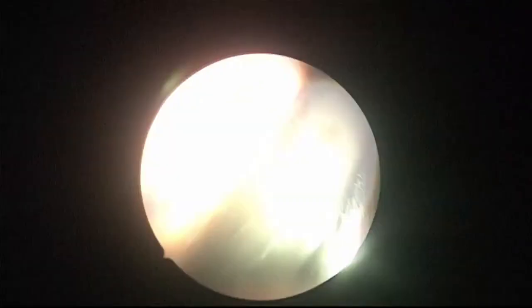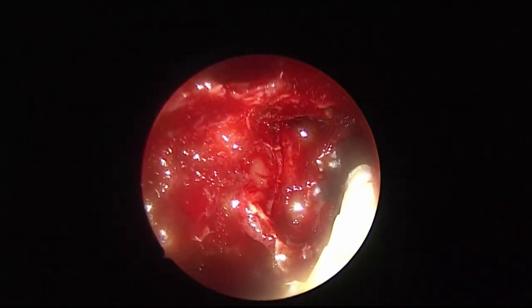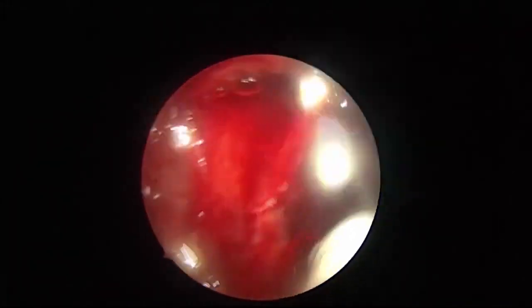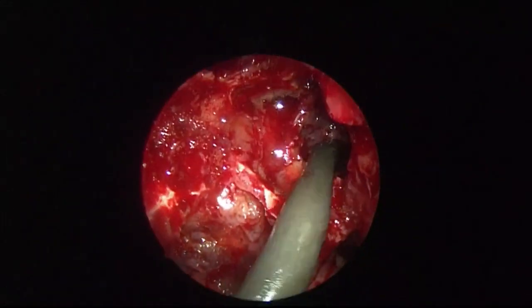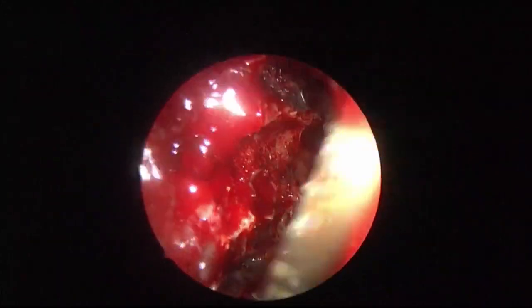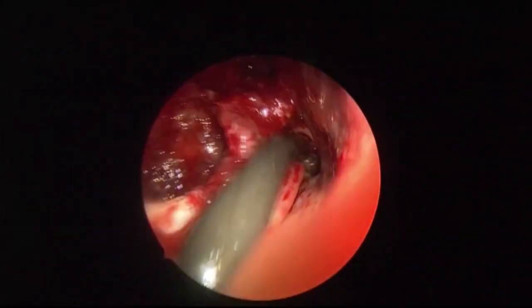With so much erosion of the sphenoid sinus, would it be a problem to use the side pressure inside? No, no, not really. See the clean water coming? Yes. No fungus. So we mopped first with a 70 degree, checked all sinuses, and finally used this hydrodebrider. I can confidently say that no fungus is left behind. Agreed? Yes.